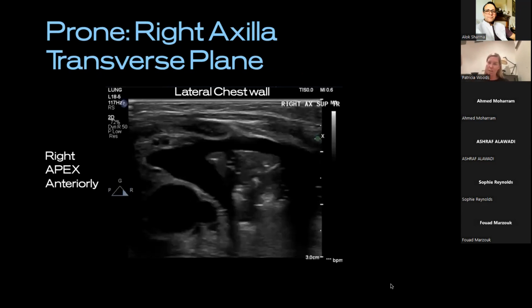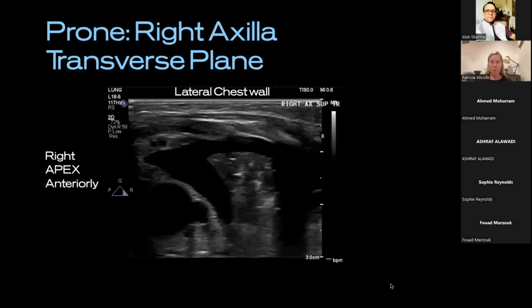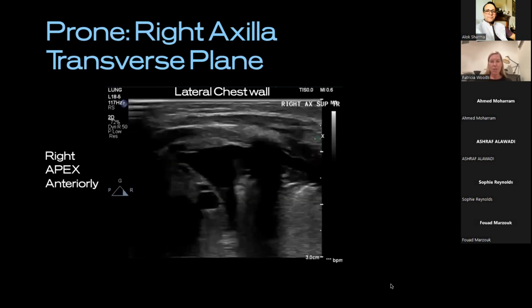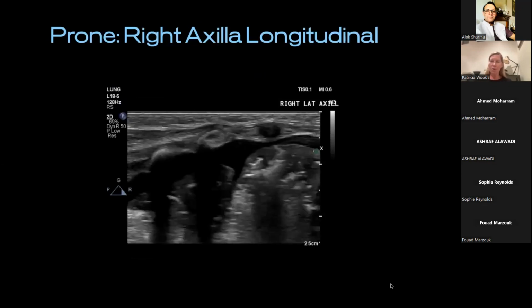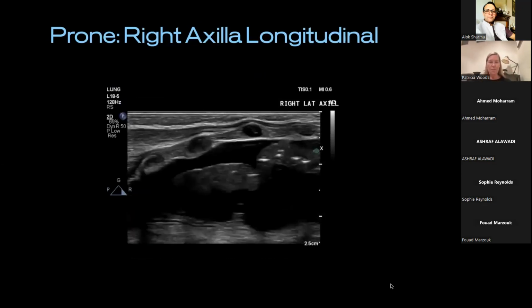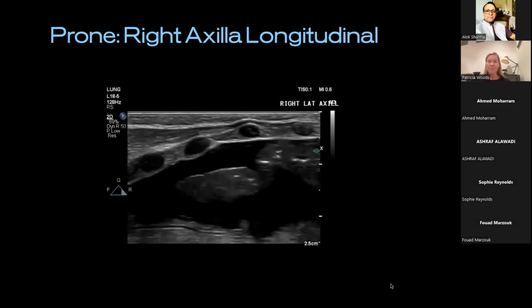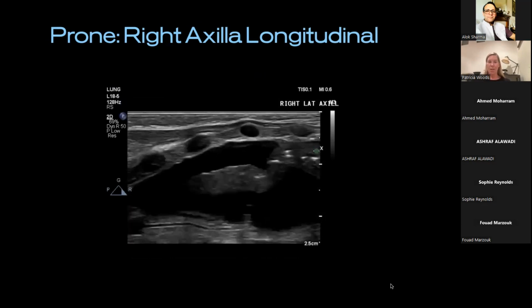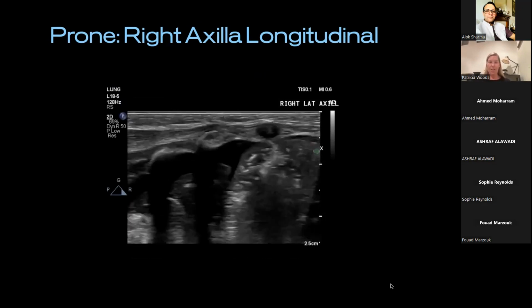So it's coming right the way around that top of that chest wall, side of the chest wall, and over the top. And as I change orientation now, I'm going to come down laterally and give myself an idea of what's happening in the gutters along this lateral side. And I think here what I can observe is a couple of different lobes of the lung, certainly not looking too happy, not well aerated, hepatization, sparkly nature everywhere.